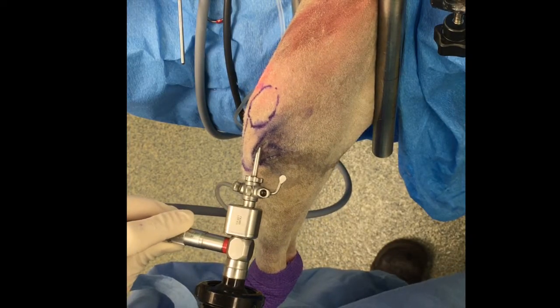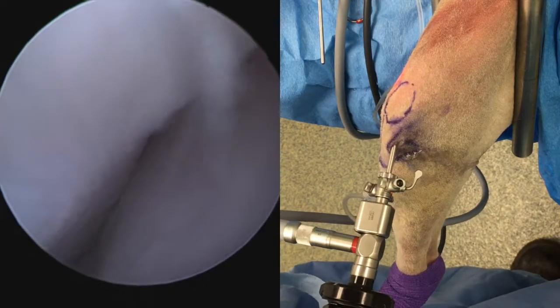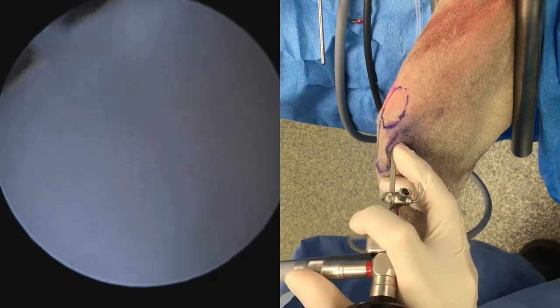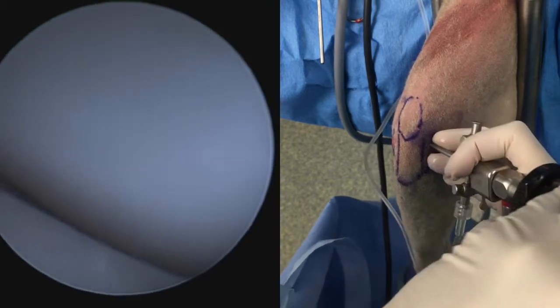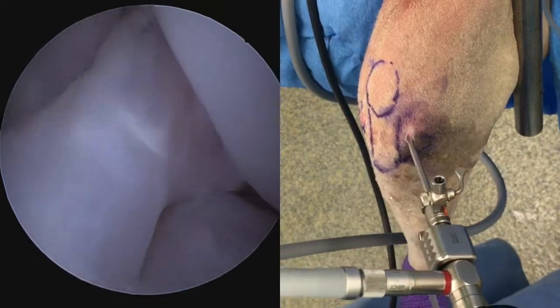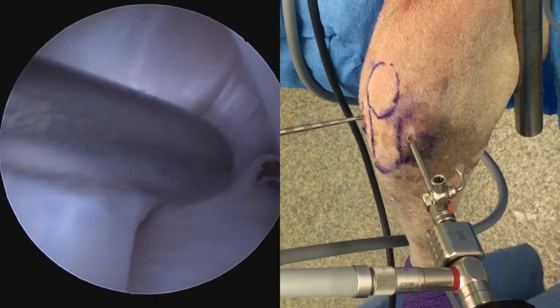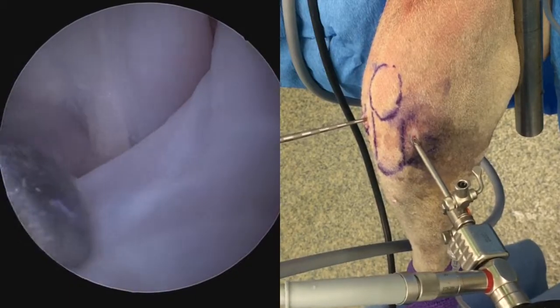Similarly, we can position our arthroscope into the medial pouch of the stifle by angling the scope up with the hand down. To the right of the screen we have the medial ridge of the trochlea, and to the left we have the joint capsule. Raising the hand, we're going to drop the arthroscope back into the medial stifle compartment. Feeling these structures with a probe is very important. Here we are probing the cranial cruciate ligament, and in doing so, more thoroughly evaluating the cruciate for pathology.